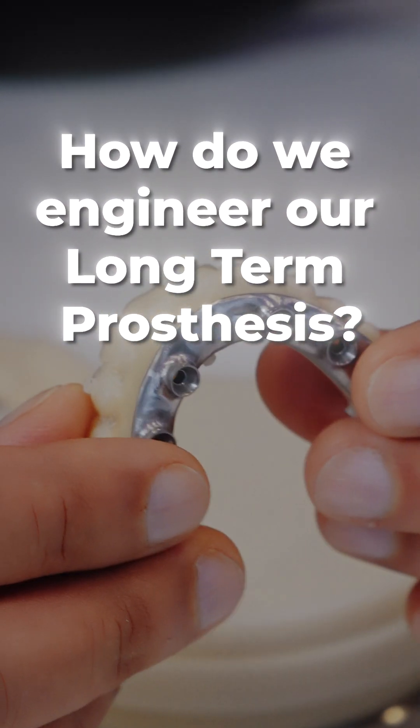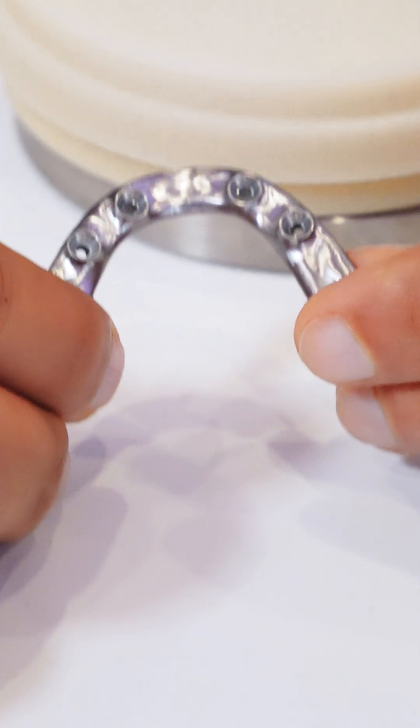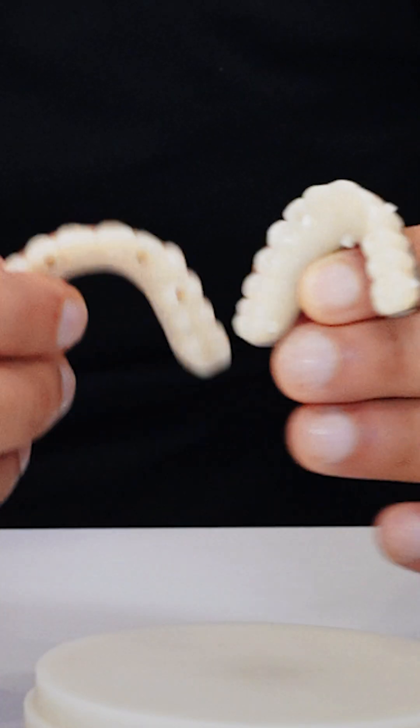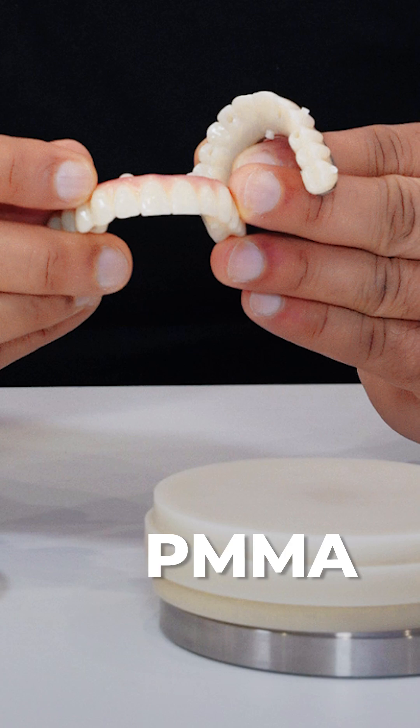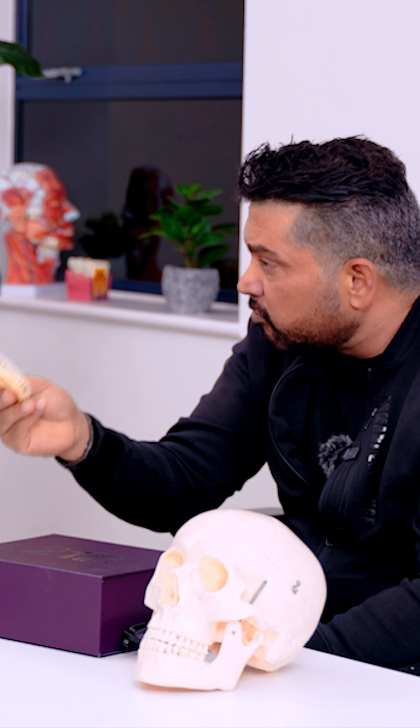How do we engineer our long-term prosthesis? This is a long-term prosthesis, made by Nelly and her team. It's two parts: the bar itself that goes in, and the veneer on top, which is made out of PMMA — polymethylmethacrylate. The two parts are custom made for every individual person. This is incredibly dense, strong material.